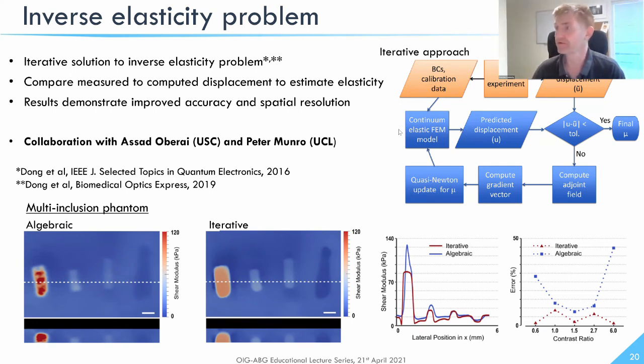We're working with a number of labs to try and give them the ability to do this imaging. I think the biggest challenge, for us as well at the start, was that we're optics people, right? And trying to understand how to set up the mechanical system. It's actually straightforward, but it's all the fine detail, like friction can cause problems. If you've got a large degree of friction between your sample and the compression plate, that can limit the ability to deform your sample.